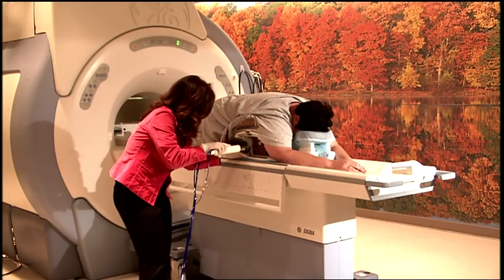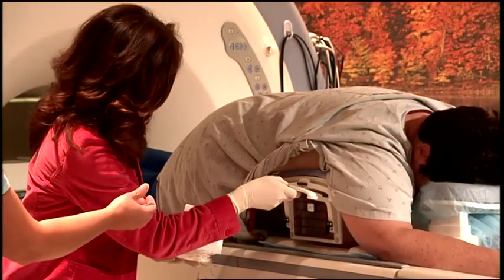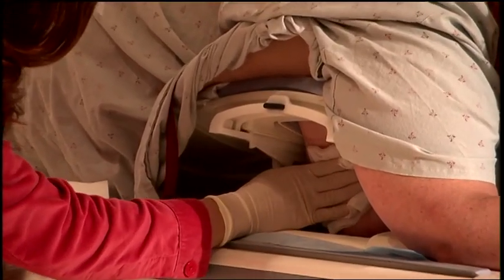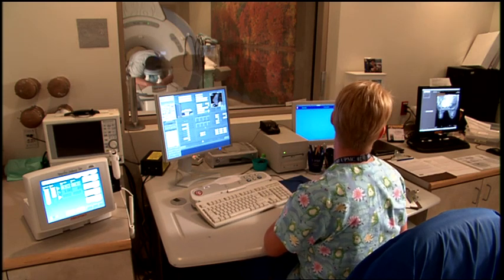When the marker is in place, the biopsy instrument is carefully removed. After the procedure, a bandage is placed over the incision site. Once the biopsy is complete, another MRI image may be done to verify that the samples are from the correct areas of the breast.